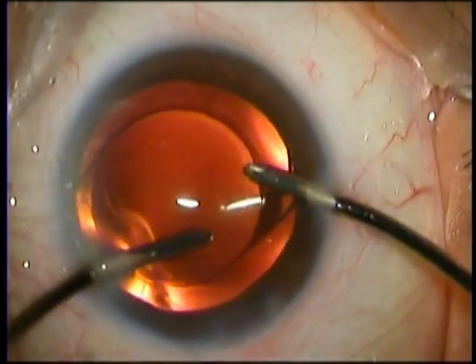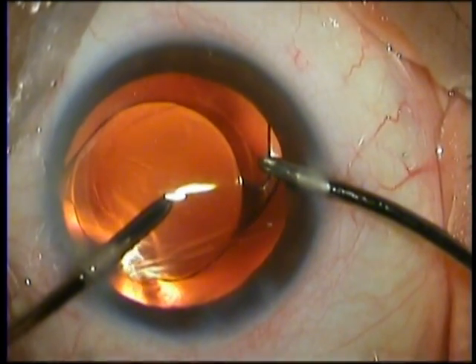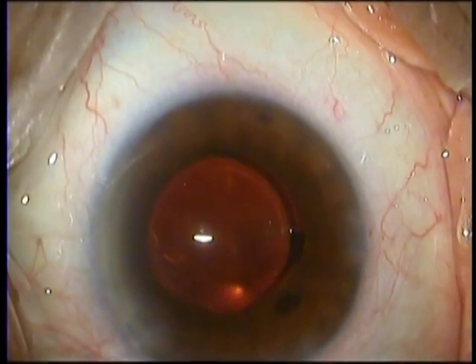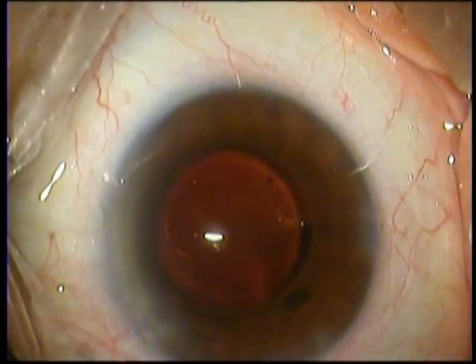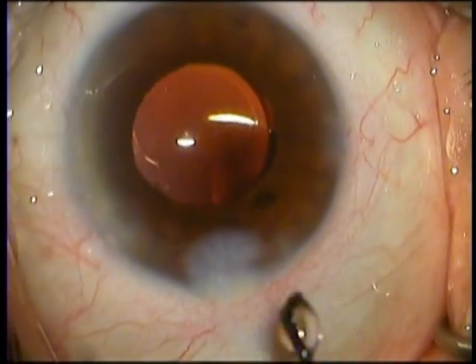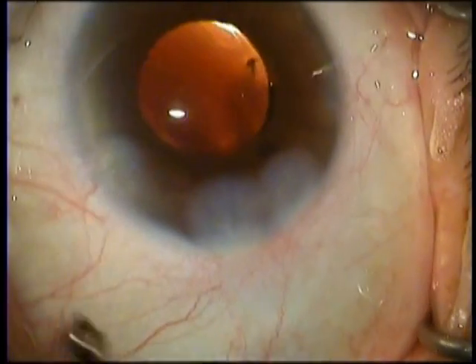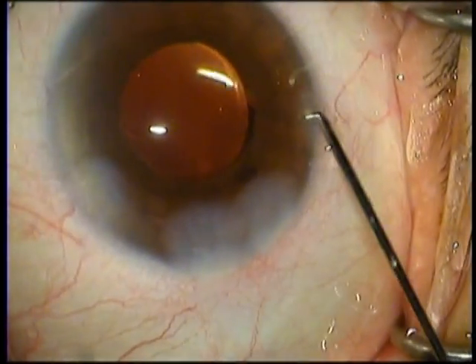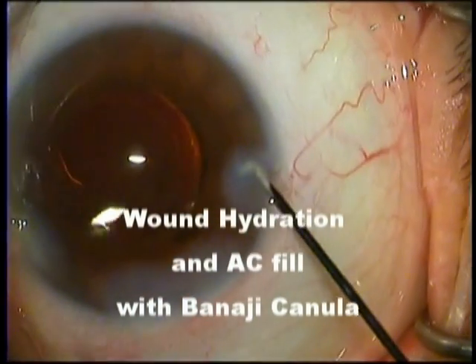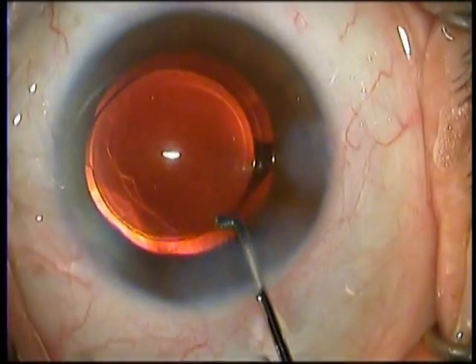Then I go into the anterior chamber with both handpieces above the IOL and aspirate whatever remaining viscoelastic is left in the anterior chamber. Once this is done, I place a little carbocol in the anterior chamber — just a little squirt — and then hydrate the wound with the Banaji cannula. It is the same cannula we used for hydrodissection and nucleus rotation, and you can see here it fits so snugly into the wound. This is what the cannula was initially designed for and then later modified to be used as a hydrodissection cannula. We can also pressurize the anterior chamber using the same cannula and with subsequent versions we will be able to do much more.